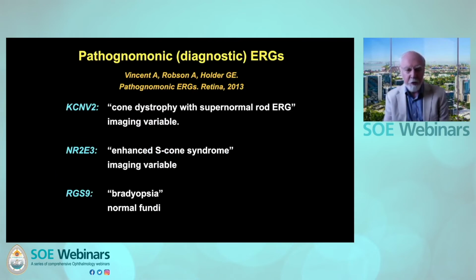Now, those two disorders were chosen because they are two of the three disorders in which the ERGs are pathognomonic or diagnostic. You need no information other than the ERG. That's rare, and these are the only three disorders of which I'm aware.